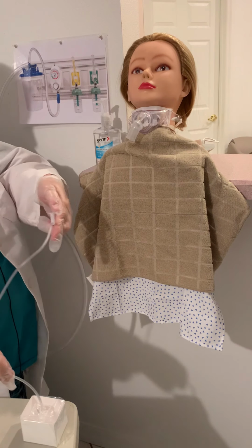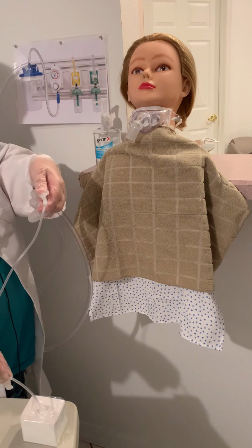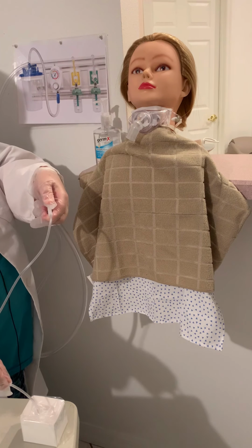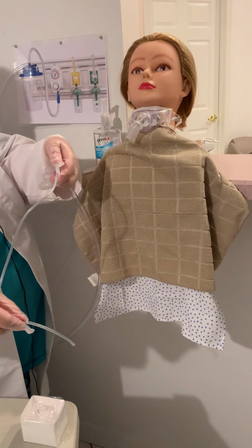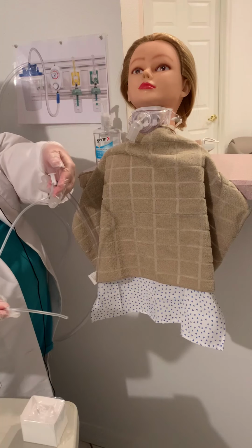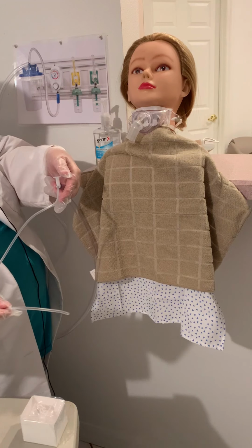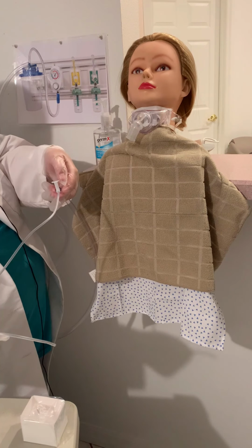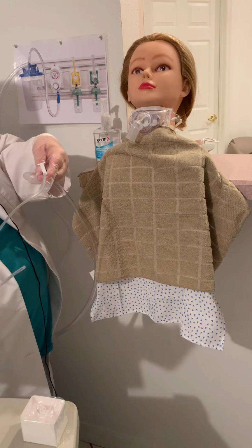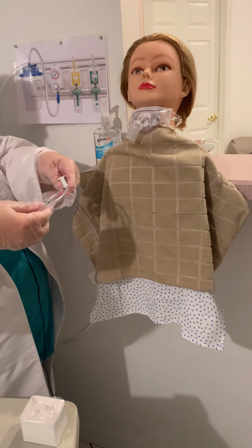Okay, we're going to dip this in the saline, use continuous suction to suck some through. We're trying to clean all that gunk that we just got out of our tube, so we're just going to suction some through. And while we're waiting for a minute to suction again, we're going to reassess. So we're going to look at her color, make sure her color is good, look for signs of dyspnea, look at her pulse oximeter, make sure her oxygen's doing okay. So just a quick visual assessment. Okay, and it looks like you may need another pass with the suction.